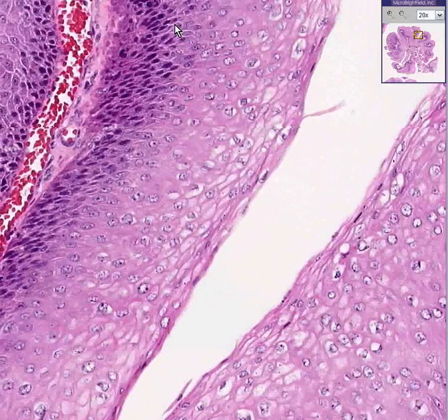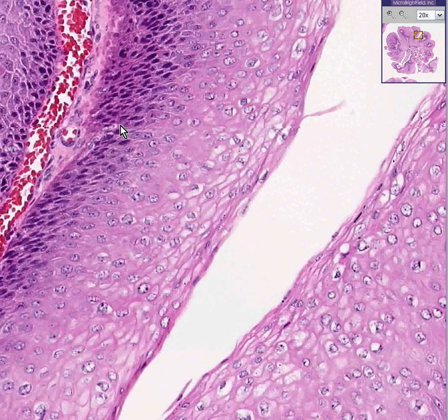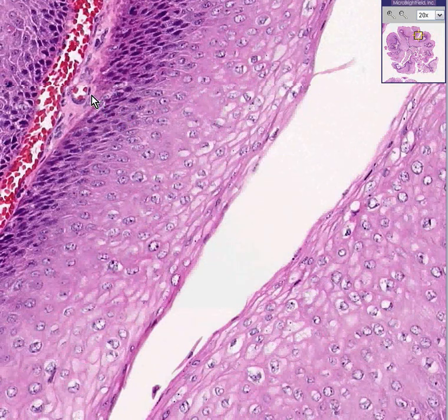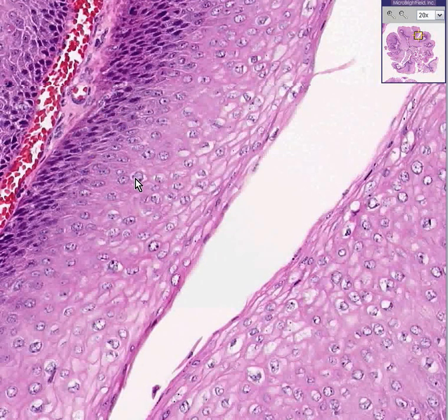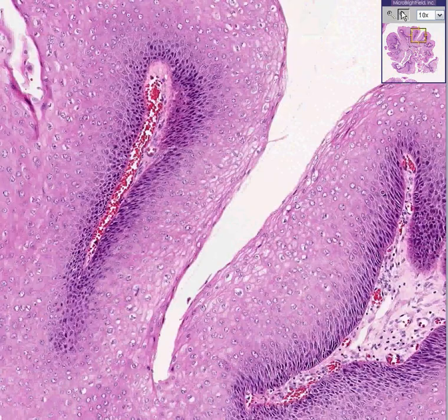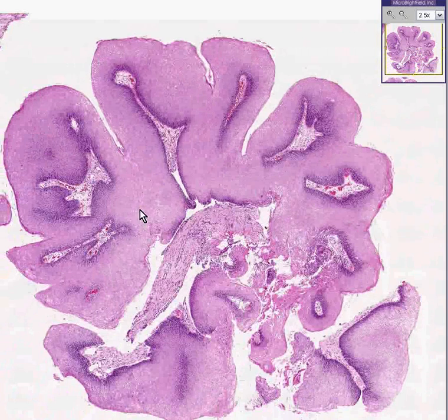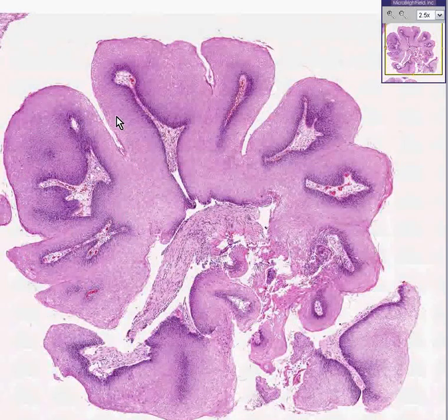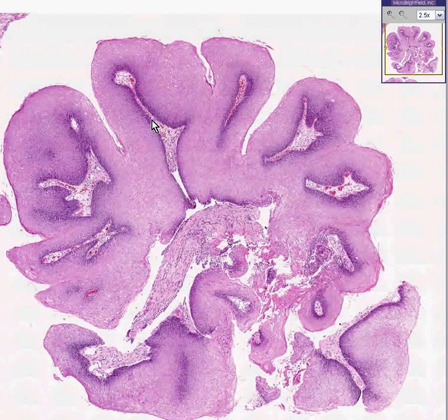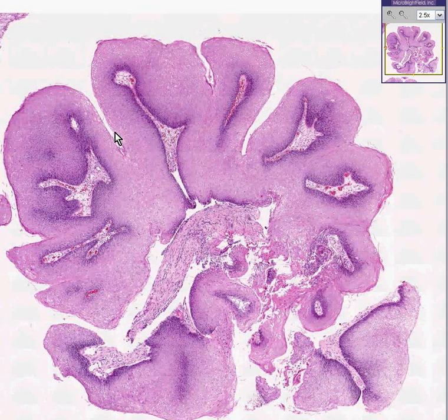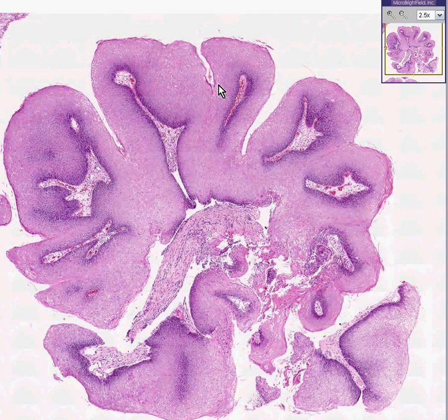There's atypia — these are not perfectly normal round cells; they're a little lumpier, bigger, and bumpier than they should be. Nevertheless, when you really back off, you can see that it looks like a very well-defined papillary structure with fibrovascular cores lined by a squamous mucosa which matures very nicely.